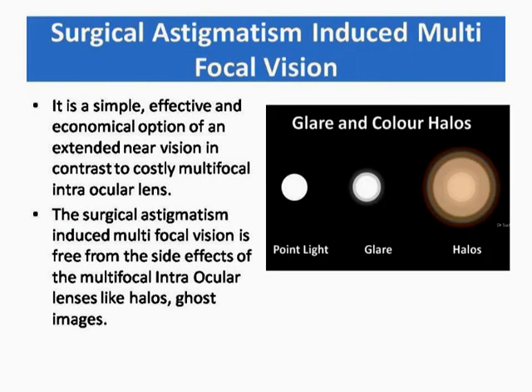It is a simple, effective, and economical option for extended near vision in contrast to a costly multifocal intraocular lens. The surgical astigmatism-induced multifocal vision is free from the side effects of multifocal intraocular lenses like halos and ghost images.